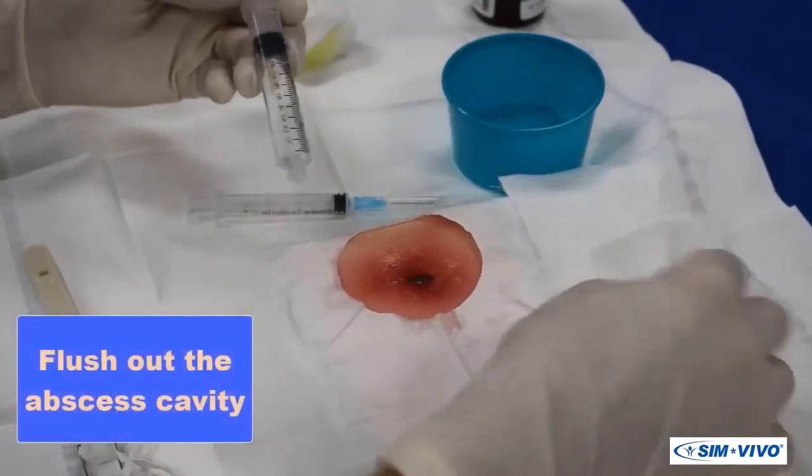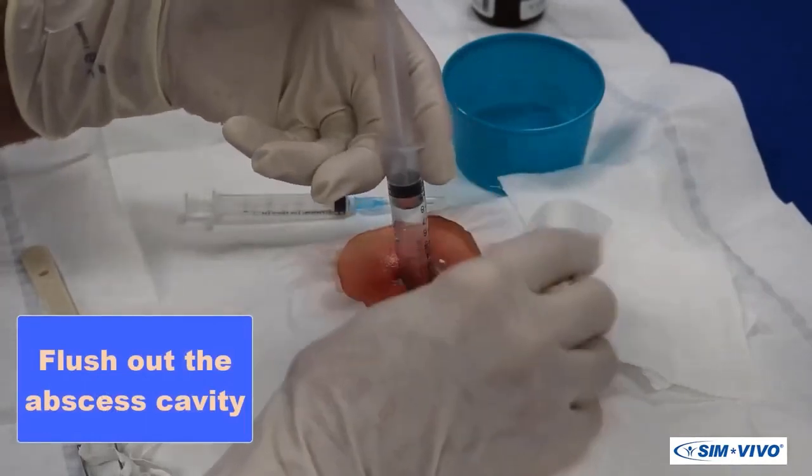Fill the 10-milliliter syringe with saline and flush out the cavity several times until the return is clear.